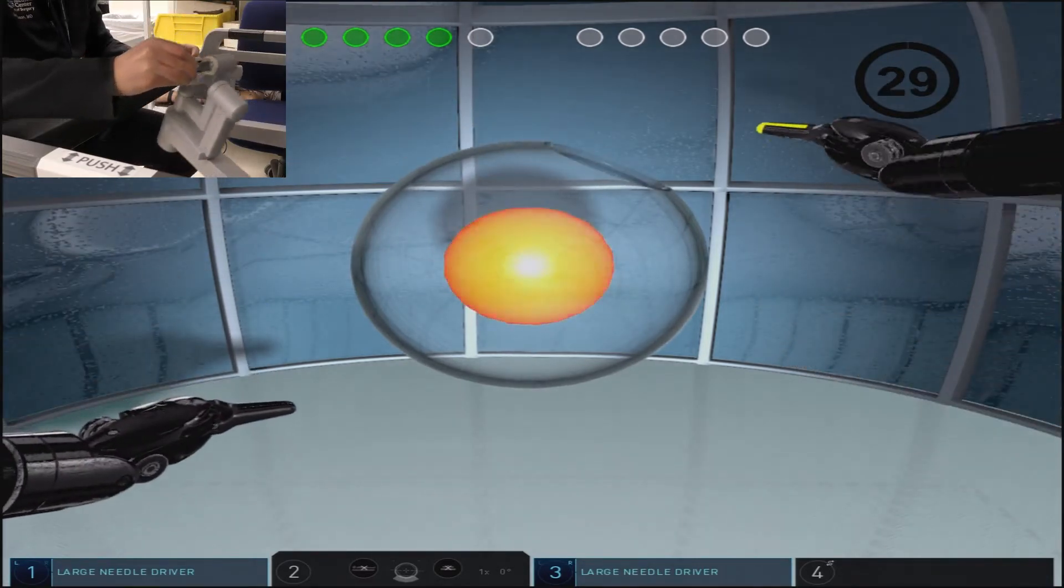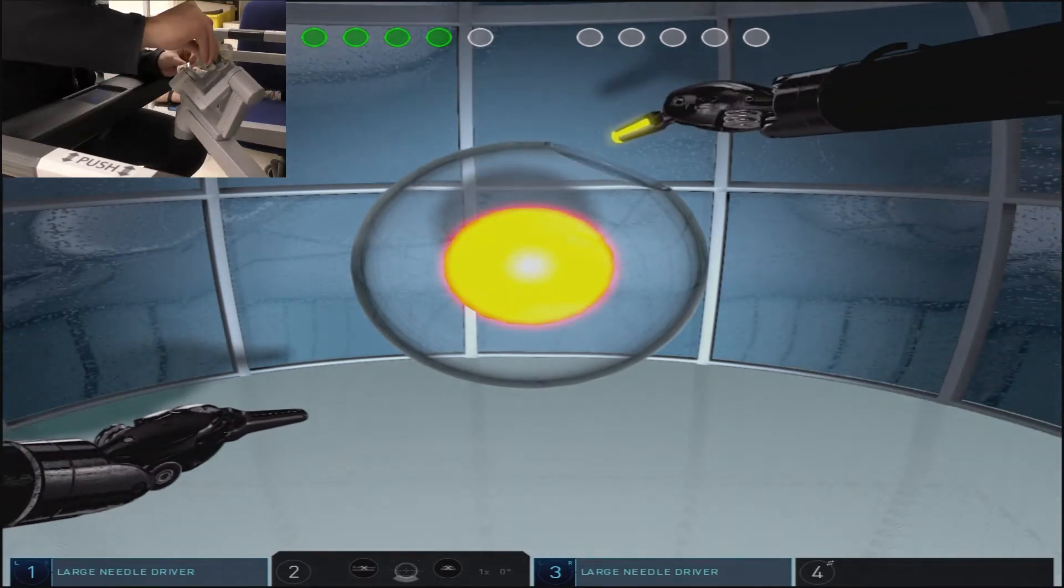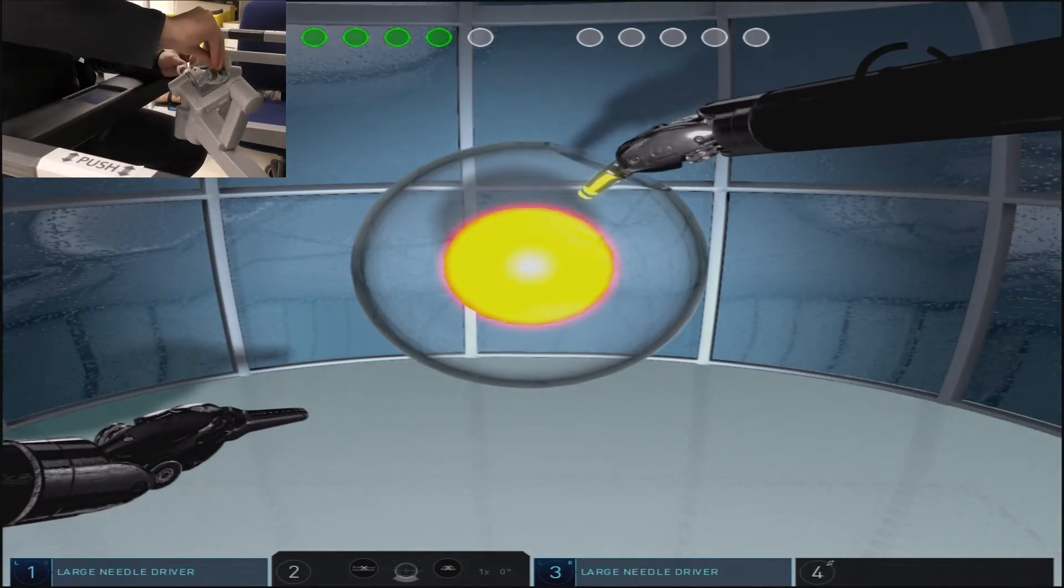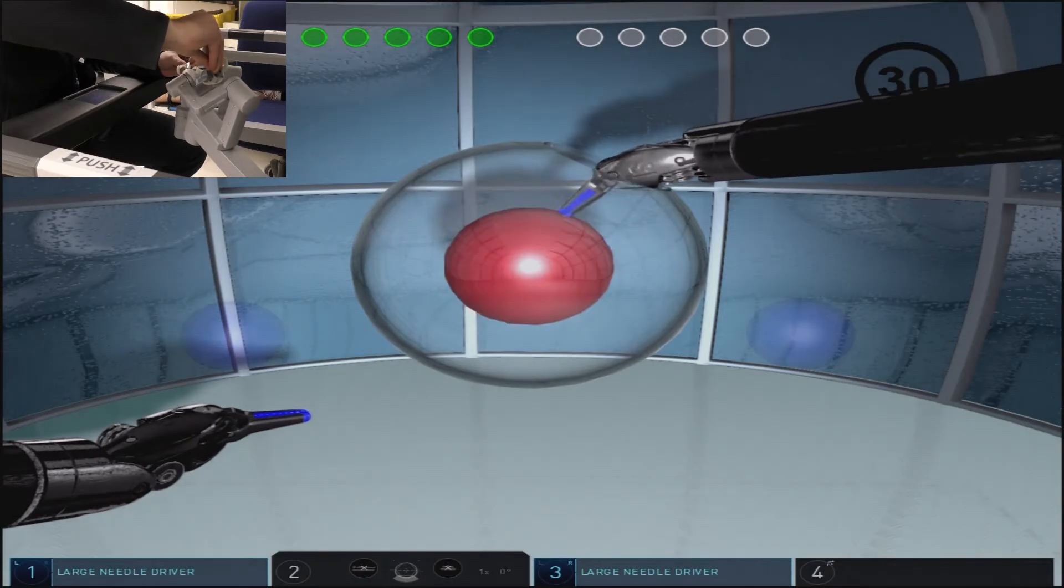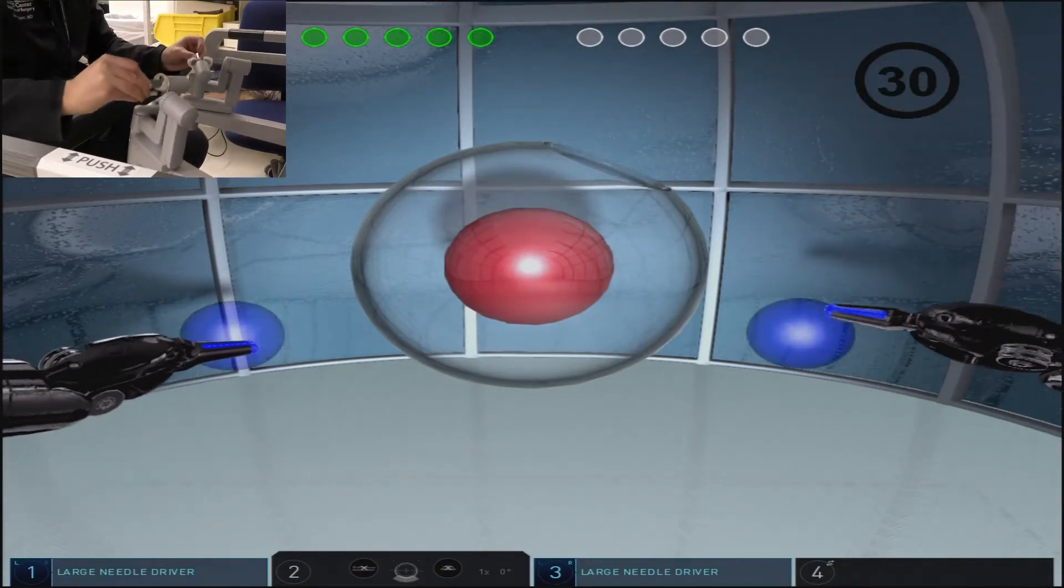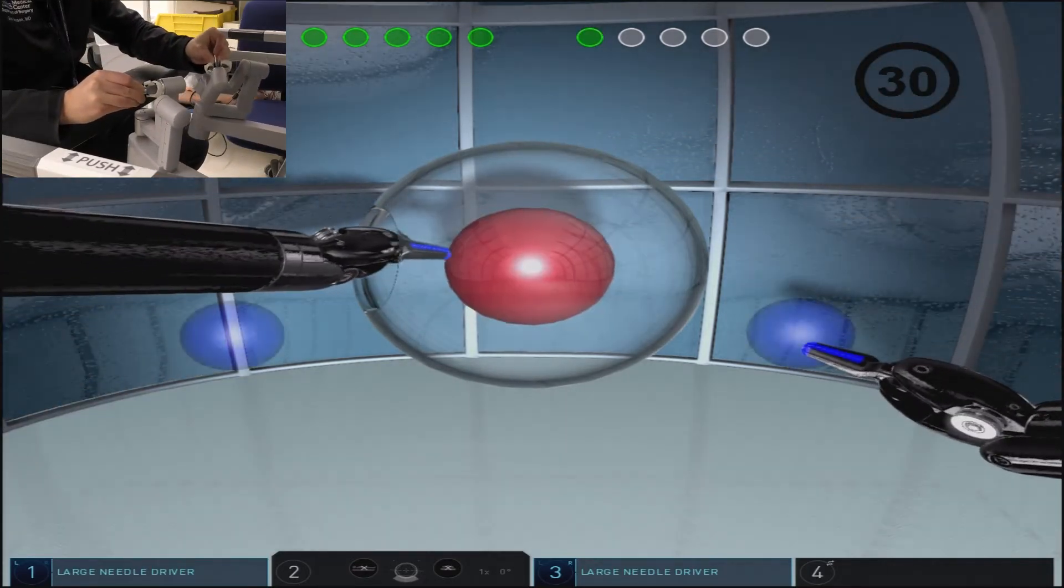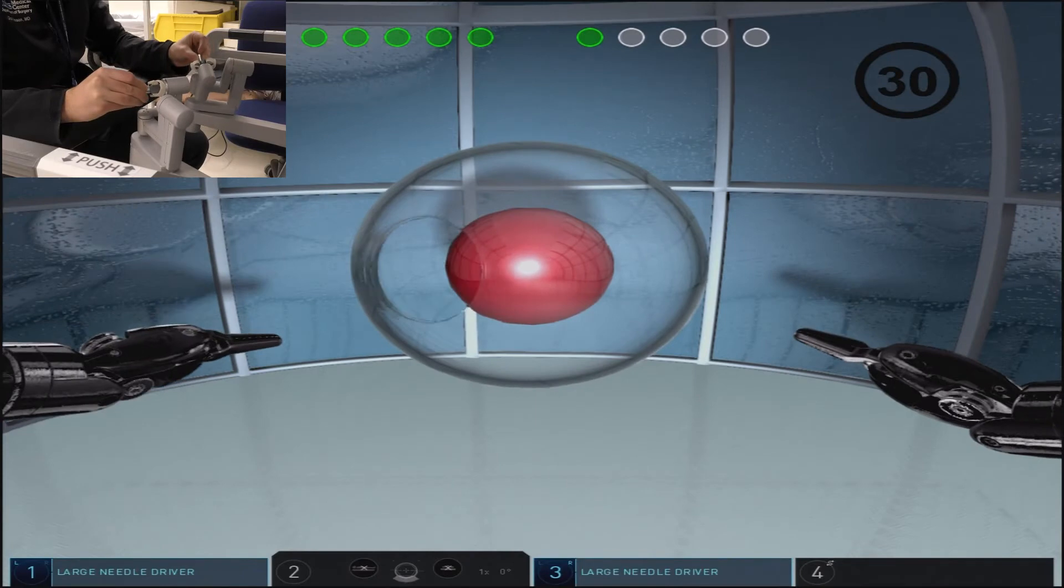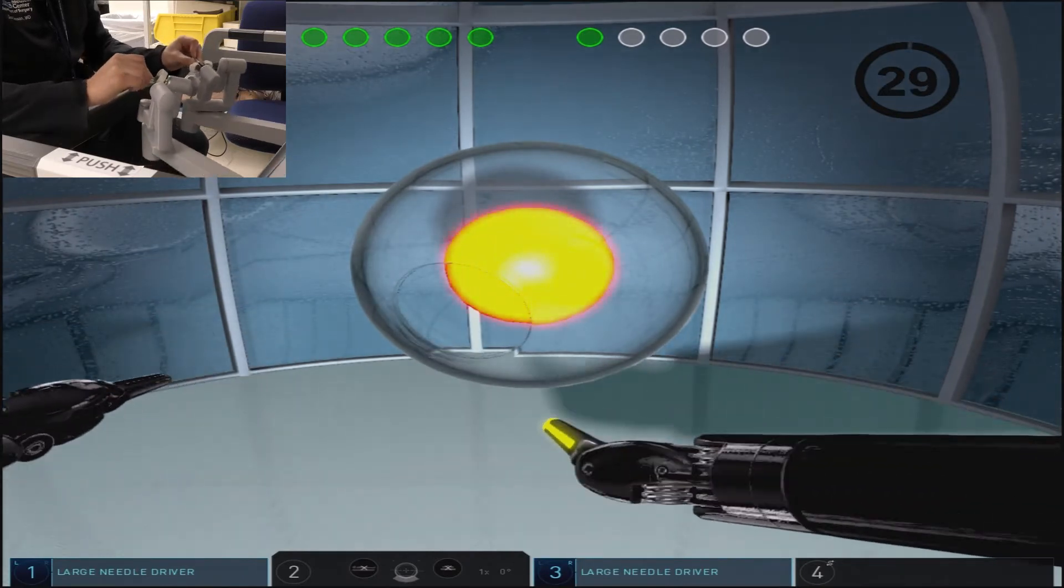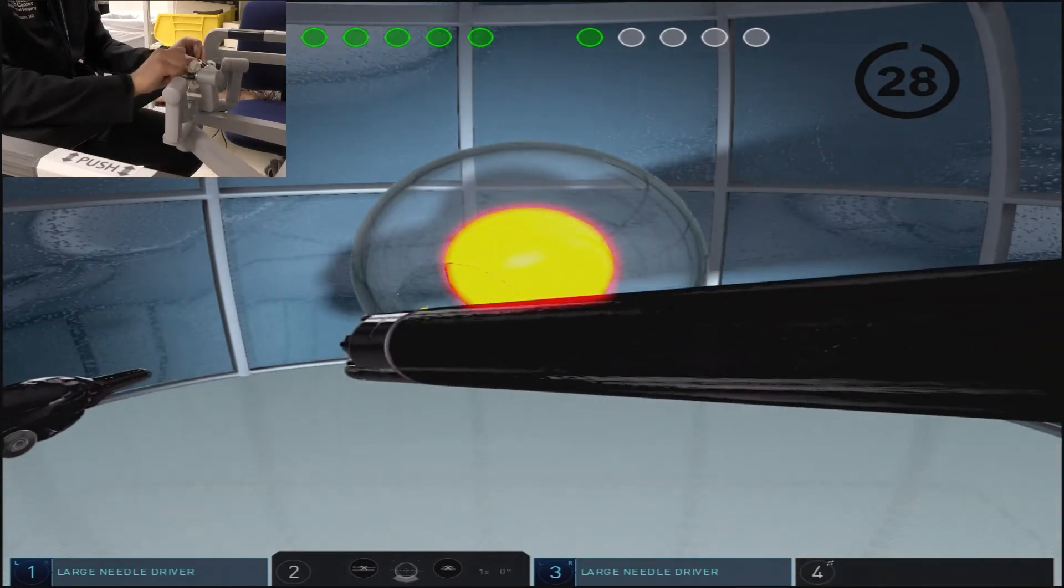By straightening the instrument as you pass through the opening in the glass globe, you'll minimize the risk of touching the edges of the globe or applying pressure to the glass globe.